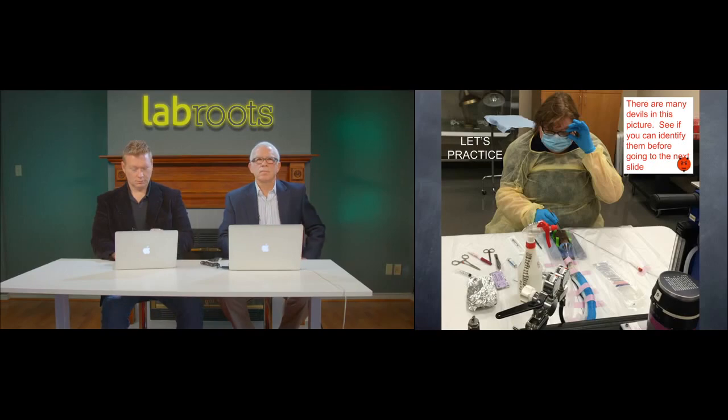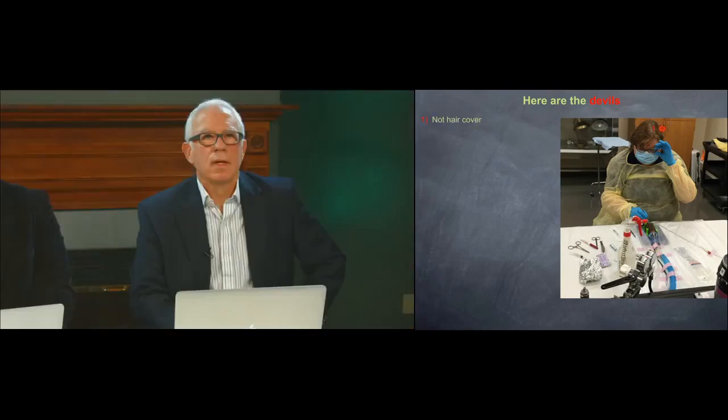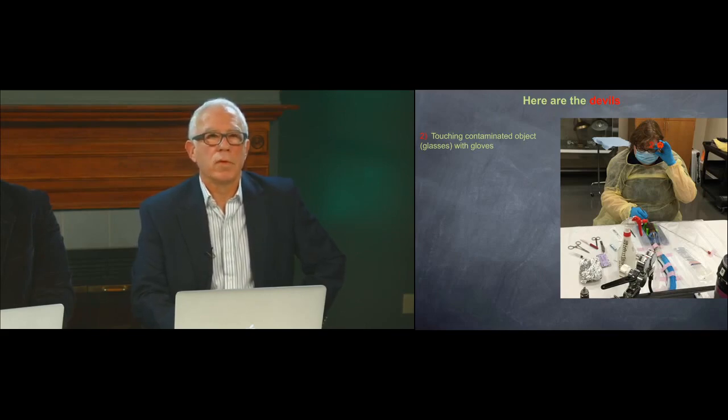Okay, are you seeing them? Okay, well, why don't we just identify them? I'll give you just a couple more seconds to look at it, and then we're going to go ahead and look at them. Okay, so number one, obviously, Lori's not wearing hair cover of any kind. Look at what she's doing. This is what I saw in that lab, Dr. Jones. She's touching her contaminated glasses with her gloves, and I saw that repeatedly during the surgery.